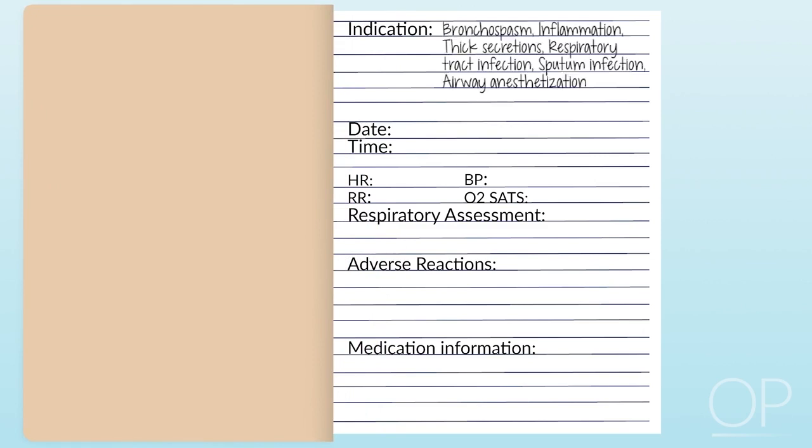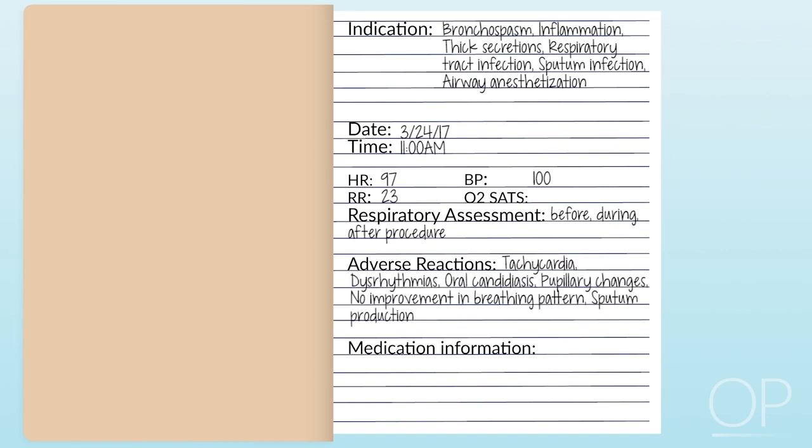the indication for the administered medication, the date and time that the medication was administered, the child's response to the treatment, including his or her vital signs and lung assessment before, during, and after the procedure, as well as any pertinent information such as observed adverse reactions or sputum induction. And of course, document the specific dosage and type of medication that was administered.